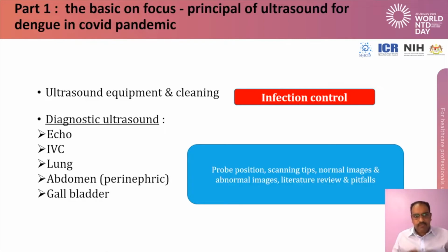So let's move on to my presentation, and this is going to be my first slide, where I'll be touching a little bit on the basics. So we will talk a little bit on the equipment and cleaning, especially focusing on infection control as we are now currently in the COVID pandemic.